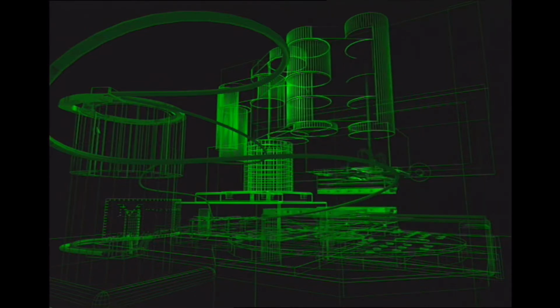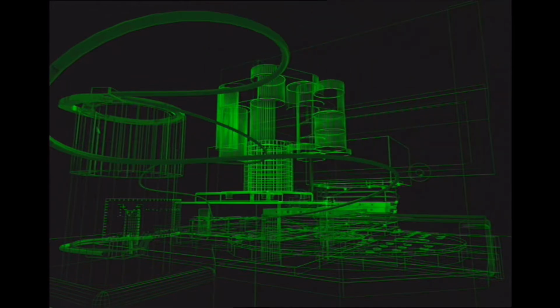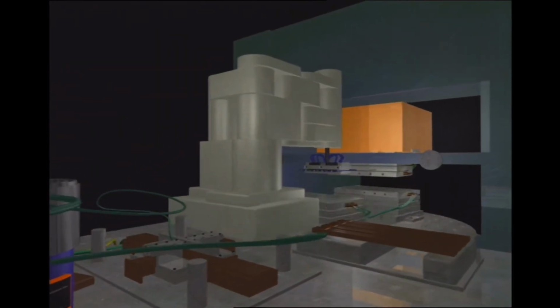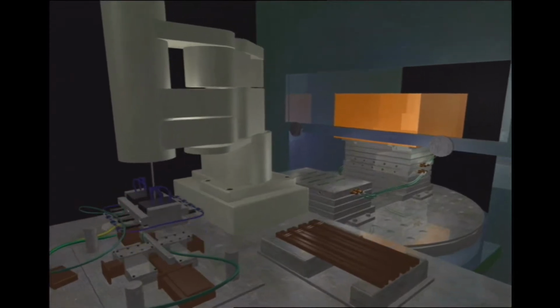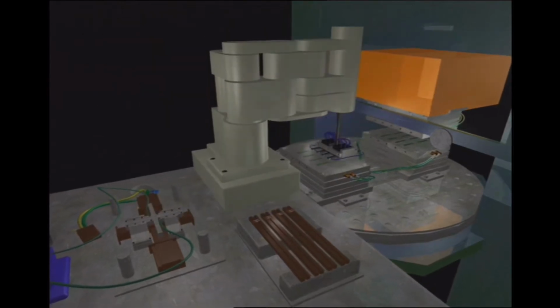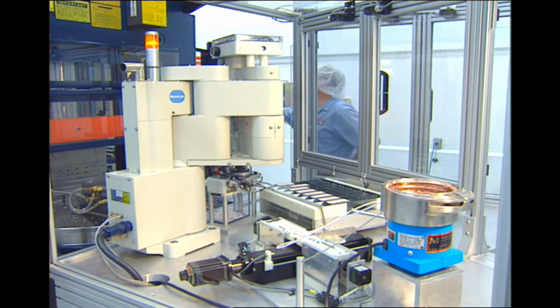Computer simulations of the critical aspects of the production process were used to optimize the machine design and layout. Using these advanced technologies, Janssen ensures that process reliability is maximized. This results in the production of high-quality product, free from the undesirable variability associated with manual production techniques. The new system is extensively tested and then validated to ensure that high-quality product is produced under the entire range of allowable processing conditions.